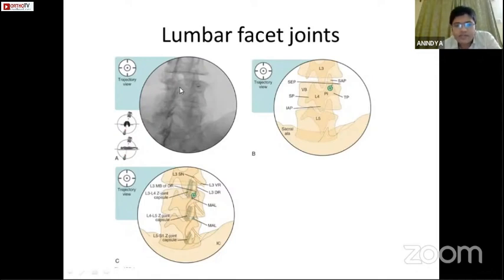Some people also do an intra-articular injection of the lumbar facet joints. So you're aiming for the medial branch, or you're aiming for the intra-articular injection. Whatever it is, the idea is to identify the landmarks in the X-ray, get your C-arm aligned well, so that you can see the joint well, identify the structures, you can see your Scotty dog well again.